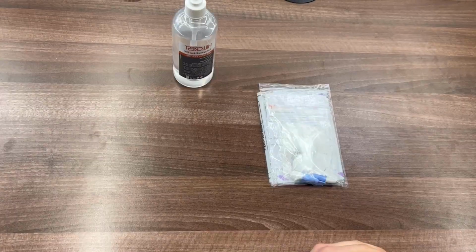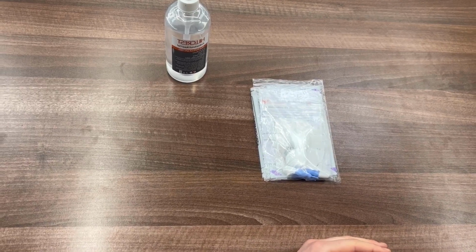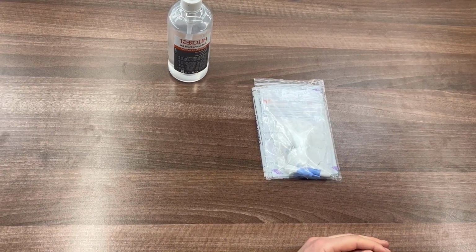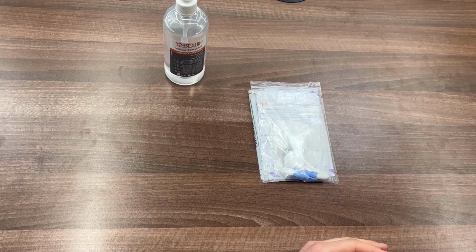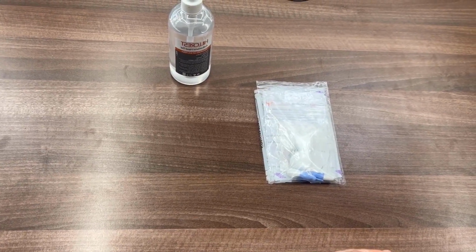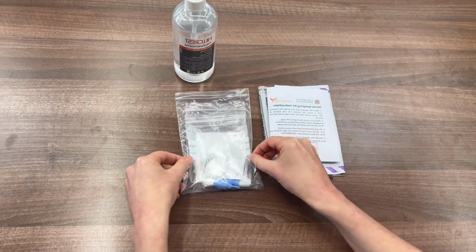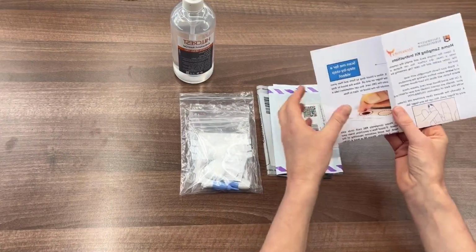What I'm going to do with this video is show you how to undertake the home dry blood spot testing kit. So you will have an envelope that arrives, and if you unpack that and throw the envelope away, you will be left with a number of different bags and some instructions.